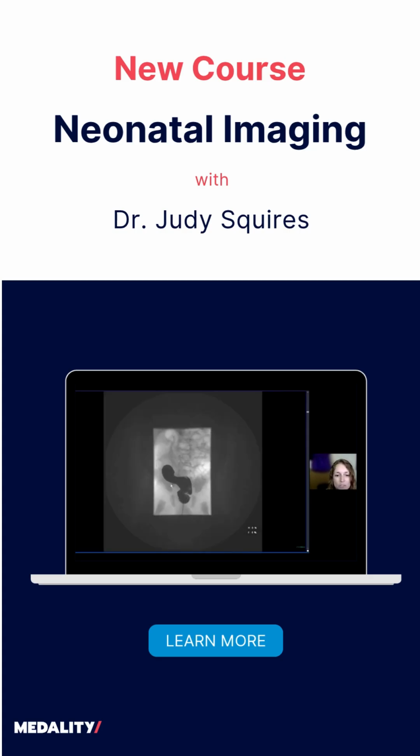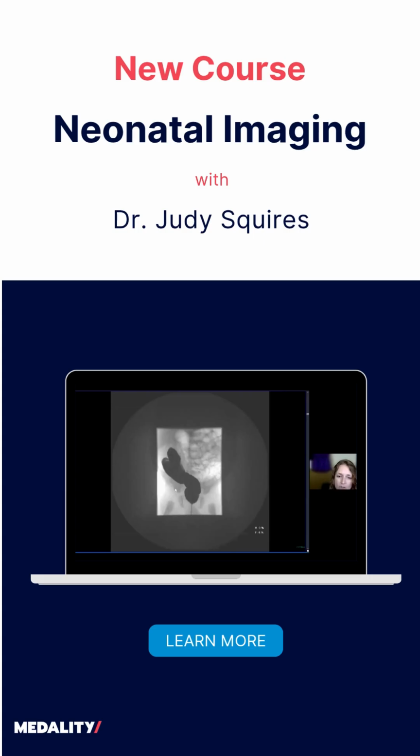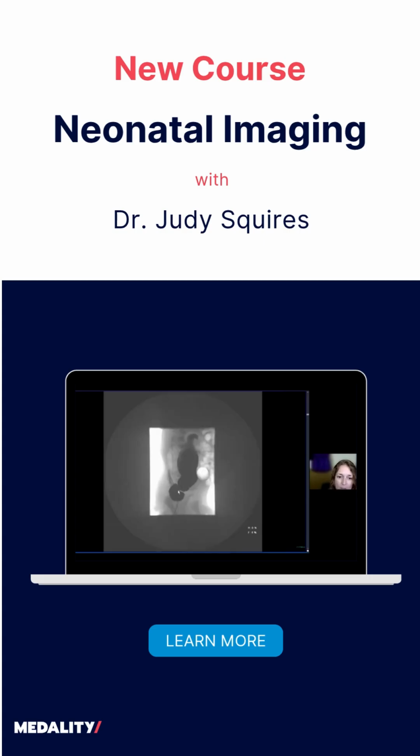And so as we continue to instill contrast in a retrograde fashion, we are at an oblique angle here. We have this clear transition point. So we have a focal narrowing of the rectum at this level with upstream dilation of colon. So this is that funneled appearance of colon at contrast enema in a case of Hirschsprung disease.